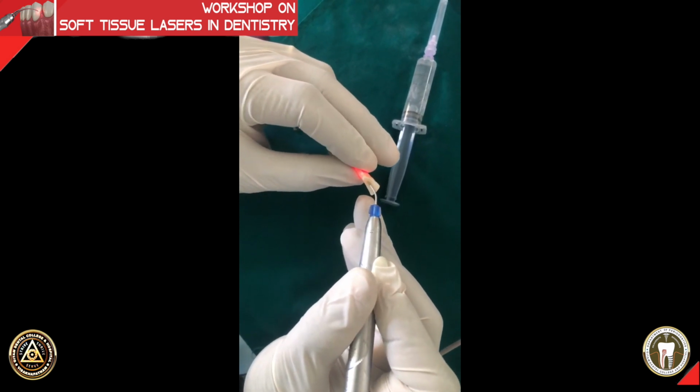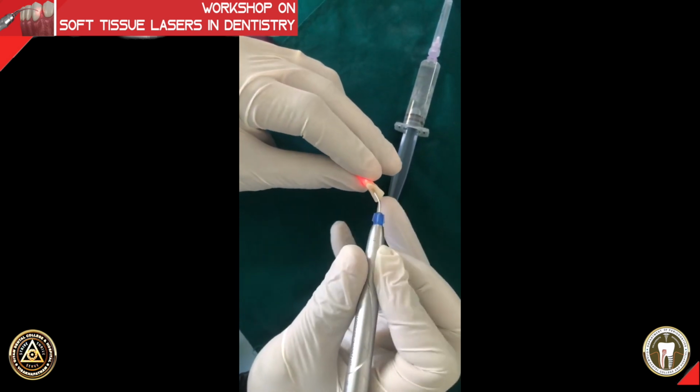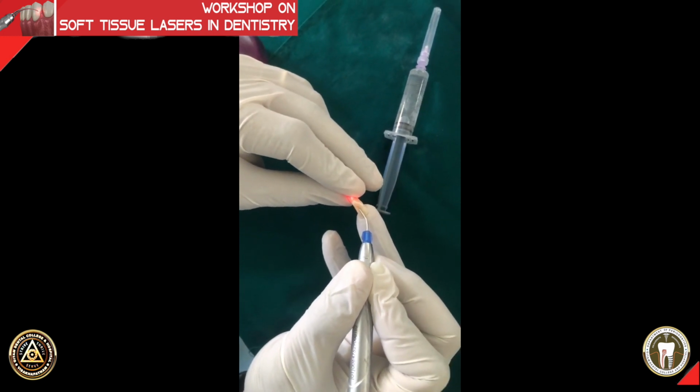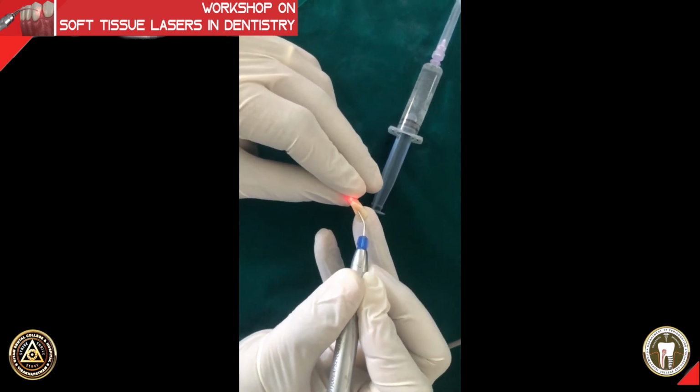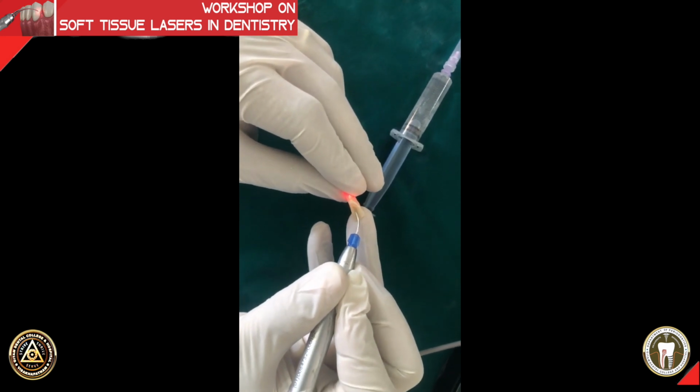Next we take the tip and insert it into the root canal, going till the apex, till the preparation wherever it has been done, and then retract by 1 millimeter. Assuming your preparation is for a 10 mm working length, you retract by 1 millimeter, which is 9 mm.